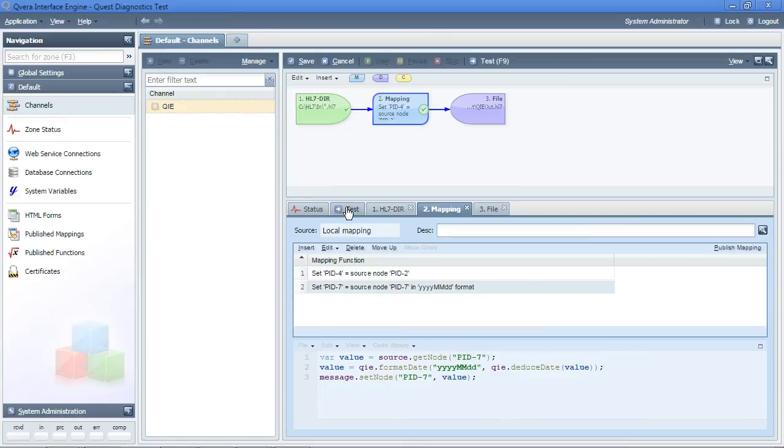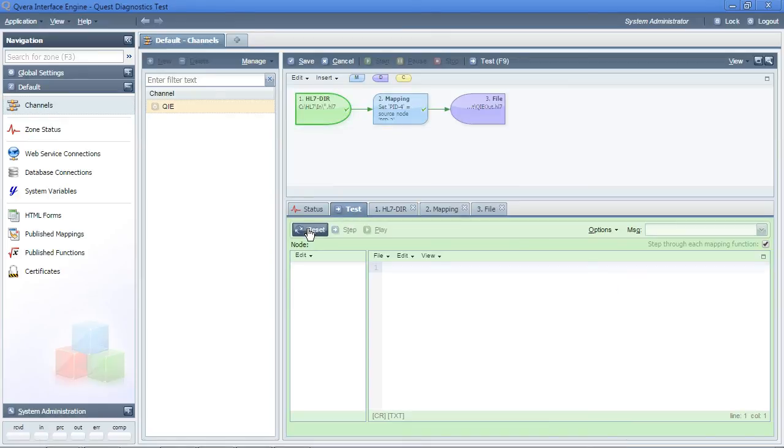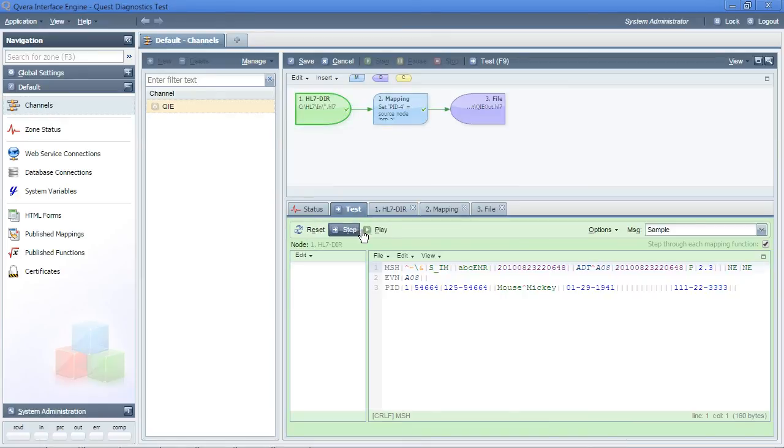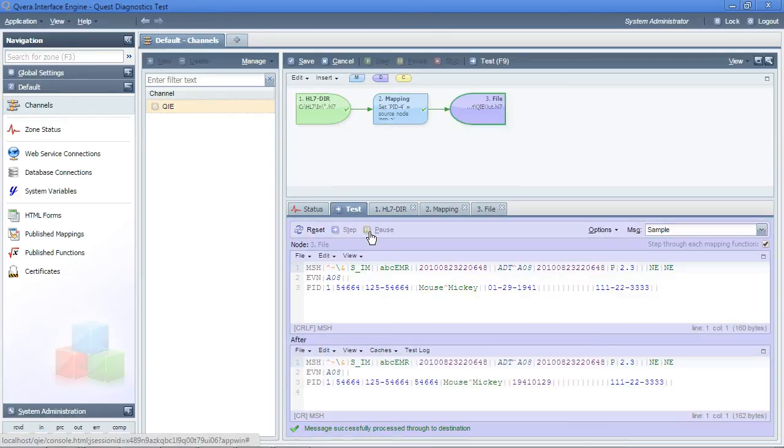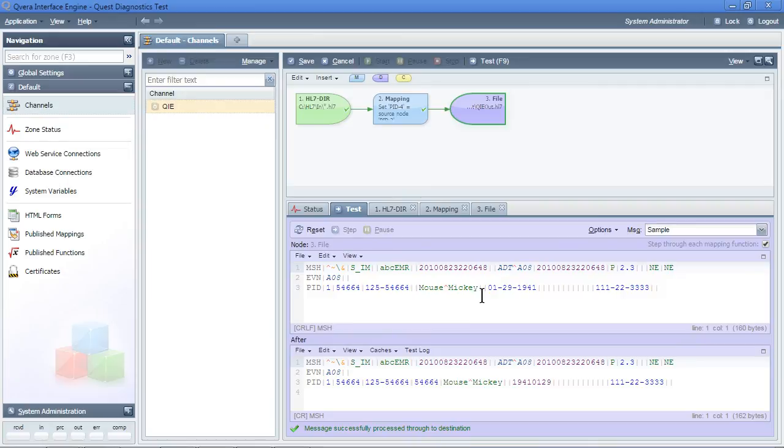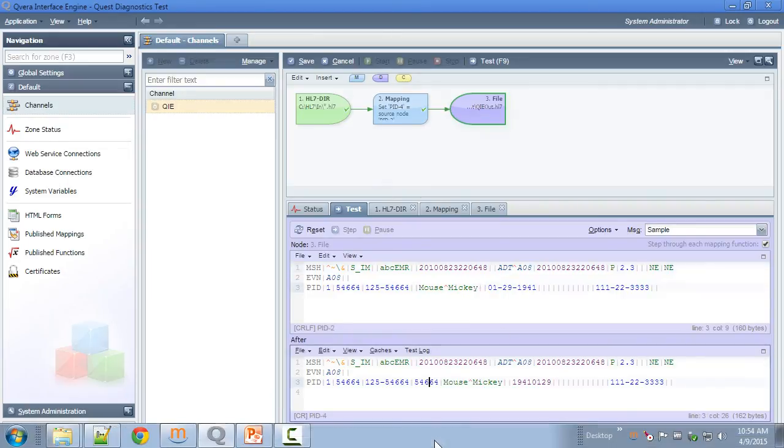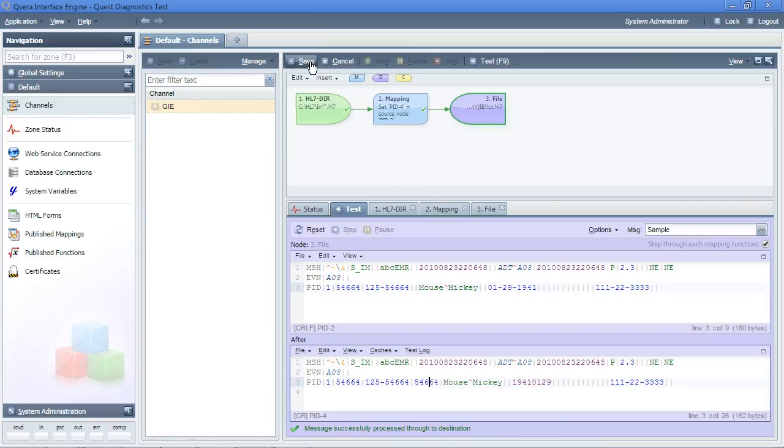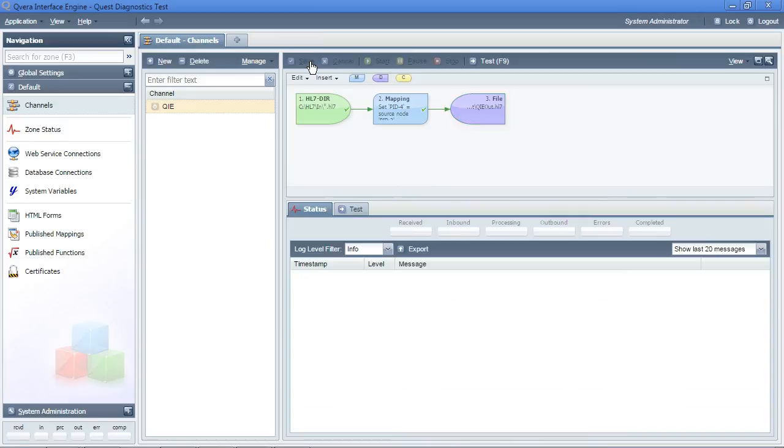Within QIE, I can test these mappings by simply going to the testing window, and I will see the before and the after. After having tested and verified these changes, I can save the channel and start it.